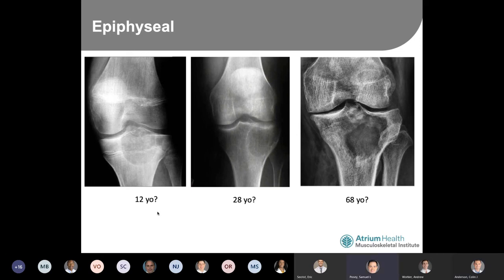Well, just based on its characteristics that I went through radiographically in the matrix, it seems more benign. So I'm thinking of a more benign chondroid lesion. What do you think about the differential diagnosis of epiphyseal lesions?